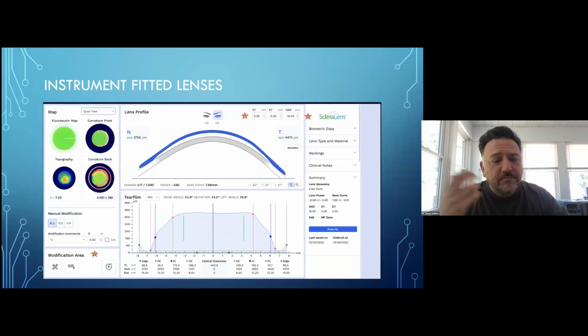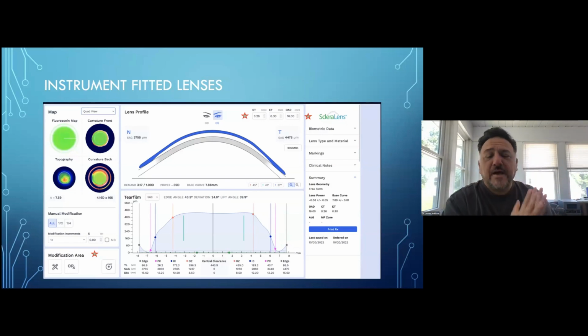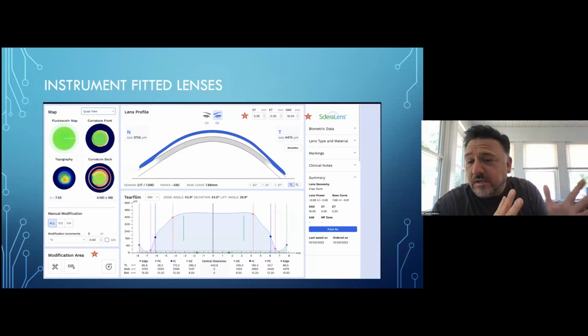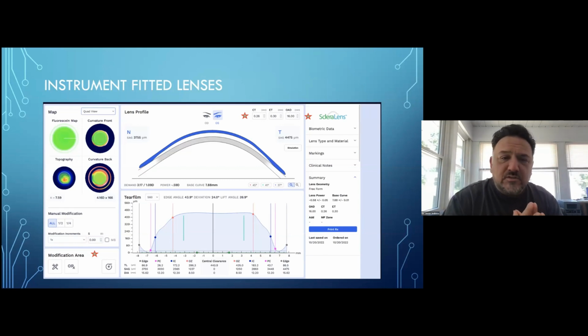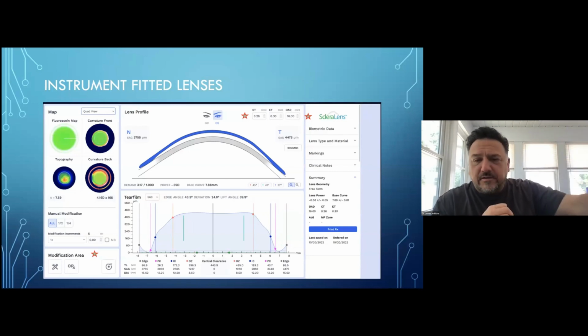This is another program that has capabilities where we just essentially take our scleral map, we import it into the software, and we allow the software to do the design. And again, in many cases, you're better off letting the instrument do the full design process first and just see what you get. Now, there may be situations where you have an understanding of the eye and some history that may impact what you allow the instrument to do.